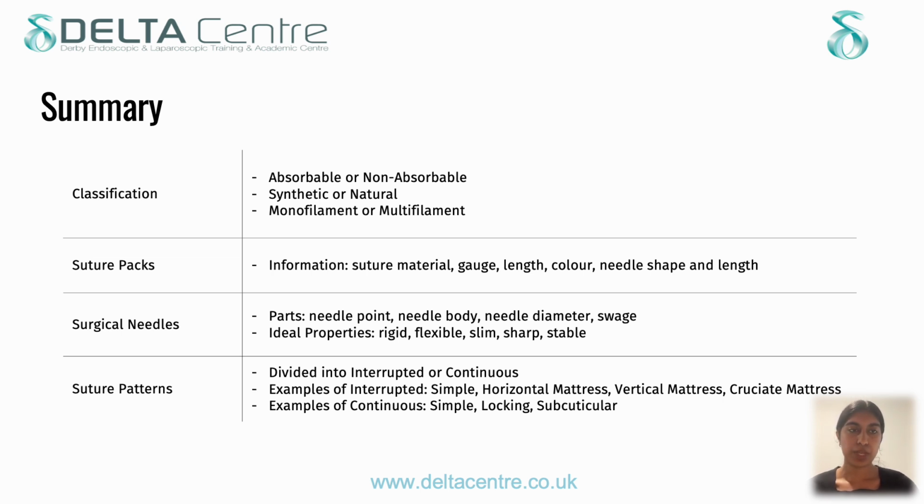So sutures can be classified based on their properties. This could be absorbable versus non-absorbable, synthetic versus natural, monofilament versus multifilament. Suture packs can give you information about the suture material, the gauge, the length, the colour, and the needle shape and the length of the needle.